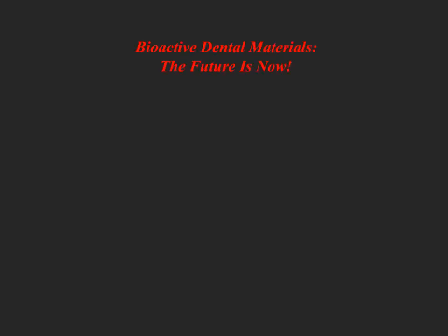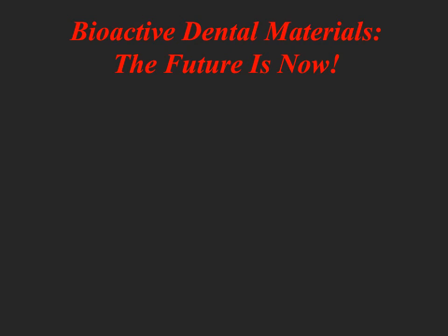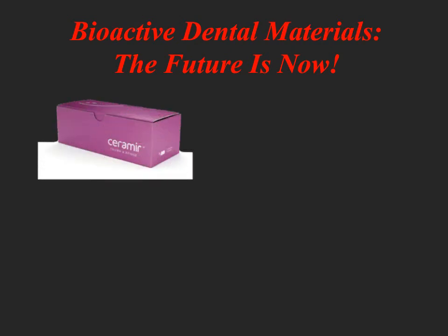So these bioactive dental materials, the future is now. Ceramir Crown and Bridge is a crown and bridge cement used to cement anything from zirconium to high-strength ceramics like E.max to PFMs. And this cement is different from any other crown and bridge cement because apatite forms on the surface of the cement in the presence of saliva.